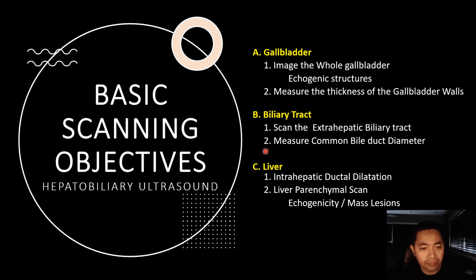Third, the liver must be visualized well also, taking note of any intrahepatic ductal dilatation or mass lesions. The overall liver echogenicity should also be taken note of.